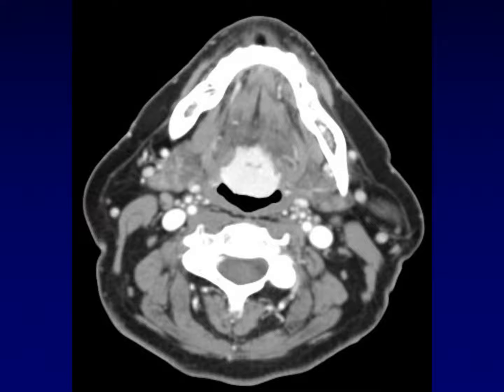Here's another congenital anomaly of thyroid development. We see an enhancing mass with imaging characteristics identical to that of the thyroid gland, but in an entirely unexpected location — at the base of the tongue. This thyroid gland never migrated; it grew at the base of the tongue and never went down the front of the neck. This is called a lingual thyroid. It will cause dysphagia, and the treatment is surgical — you can simply remove this ectopic tissue.